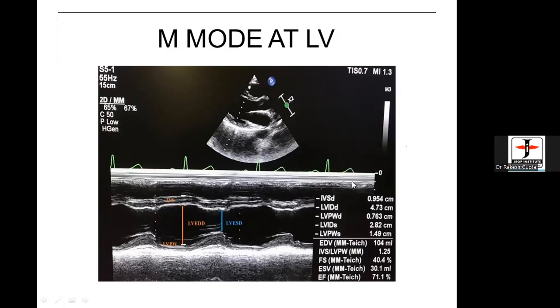I'll show you a video recording of those cases which I did with an artificial intelligence machine. But those were cases which had excellent imaging quality for demonstration. I had to choose out of 10 patients; I could choose only one. And it is an art, which comes by very much experience. It's a learning process. It takes time to learn. Bottom line is a good image.